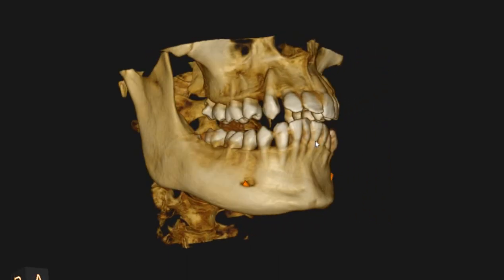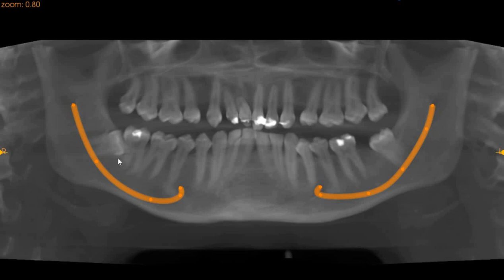Taking you to the panoramic view, on the panoramic view we can see that both the wisdom teeth are closely associated with the inferior alveolar nerve. We've got the lower right second molar which is closely associated with the wisdom tooth, and we have a missing lower left second molar.